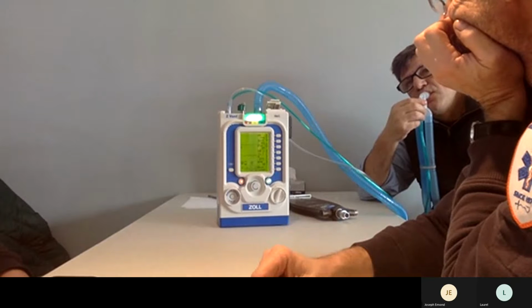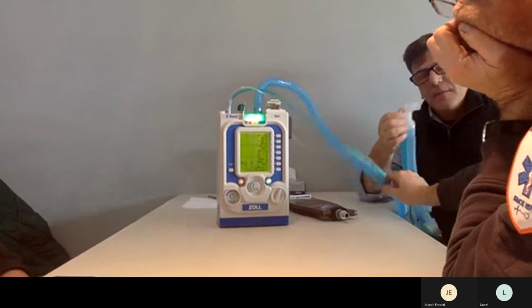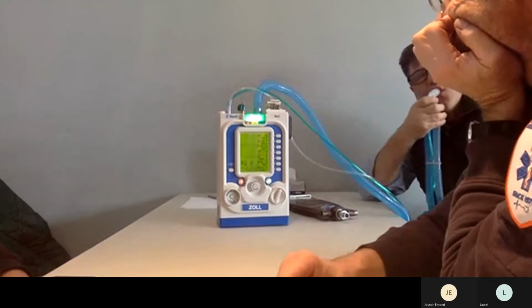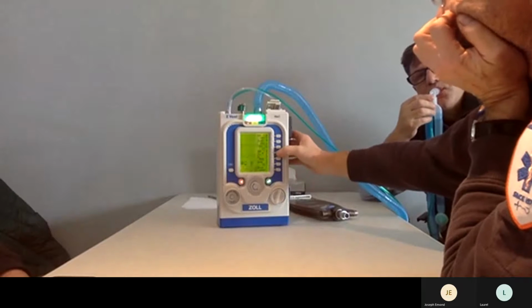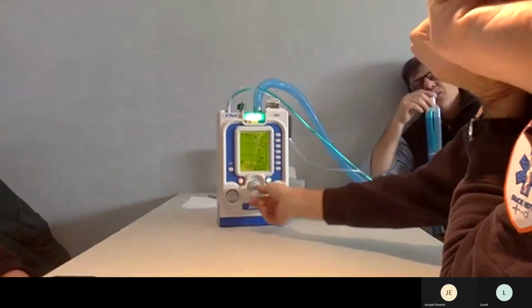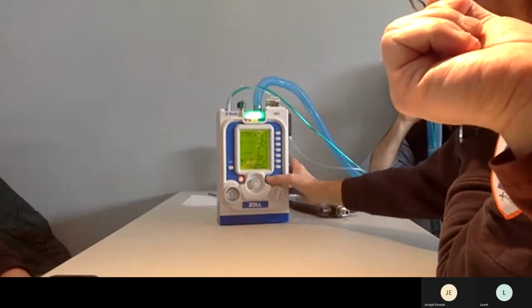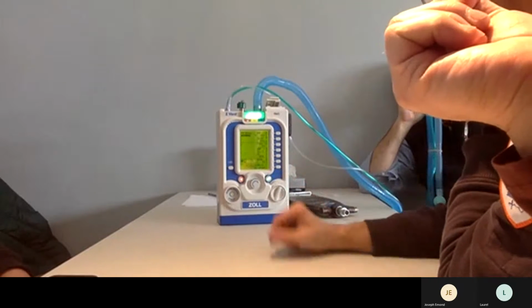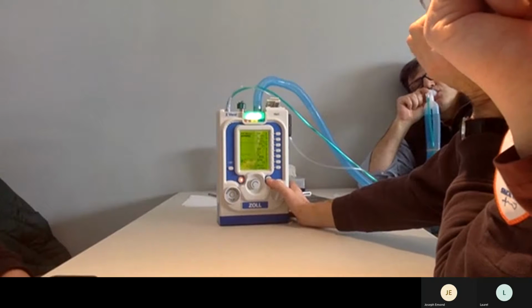Just a little work of breathing, right? Not much. Now, when you changed the trigger, how do you do it? You hit the PIP button, hold it, and it pops up there. Then you turn it minus, as low as minus 0.5.